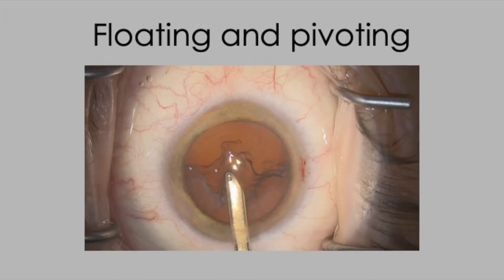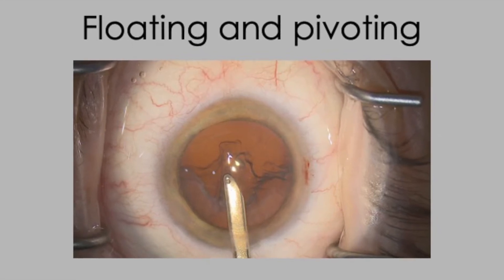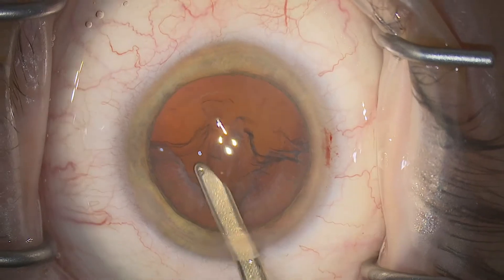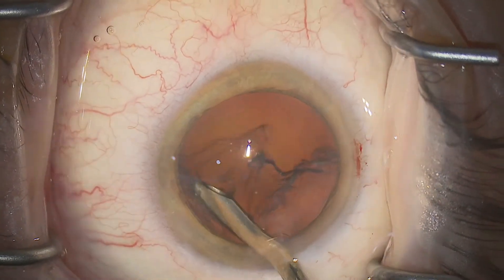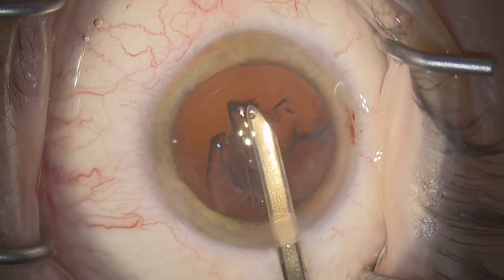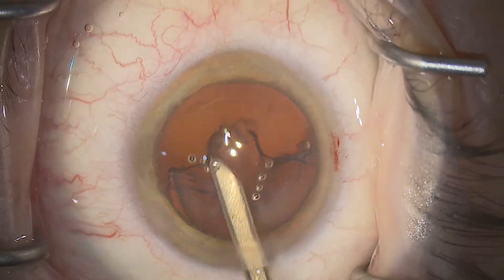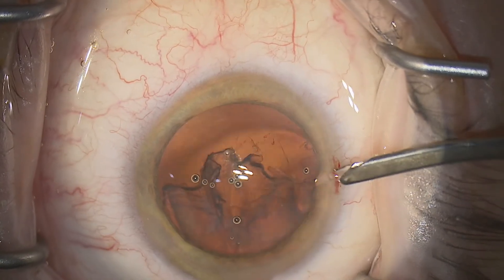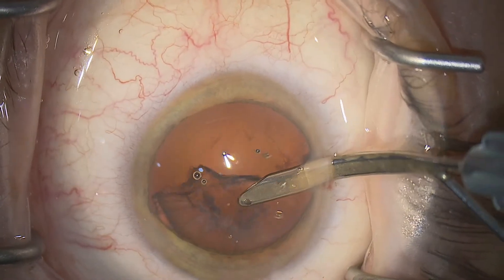Remember we're floating and pivoting all the time, not sitting down the entry site, avoiding excessive aspiration, and not collapsing the anterior chamber. If anything, I recommend a very subtle lift when you're working through the main entry site in order to keep the anterior chamber nice and full. And as soon as the angle is less than optimal through the main entry site, you can come to your side ports.